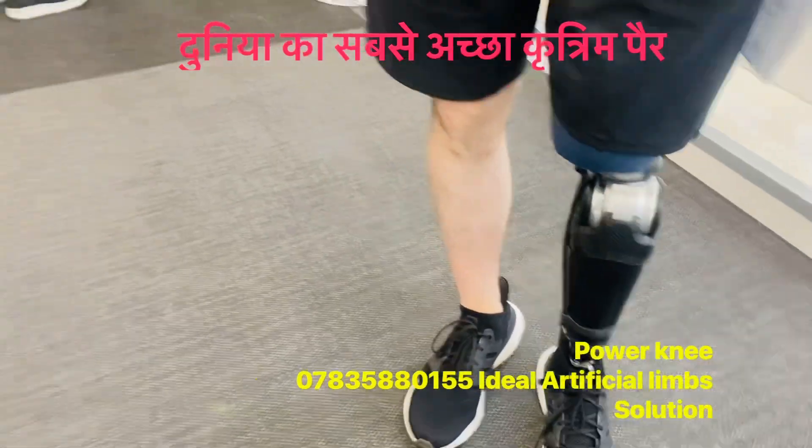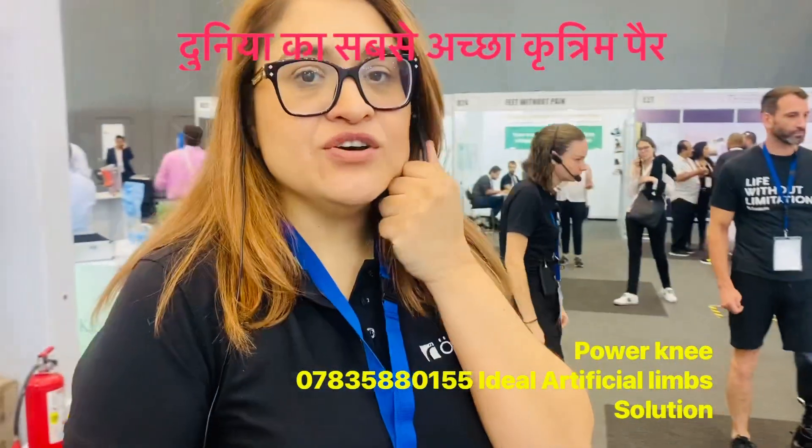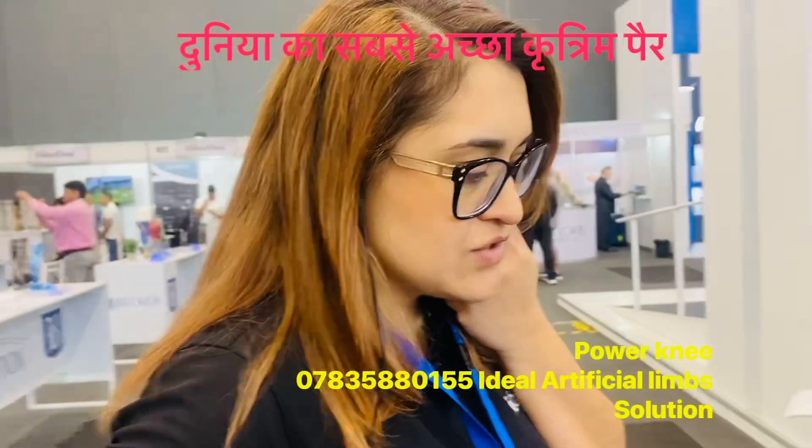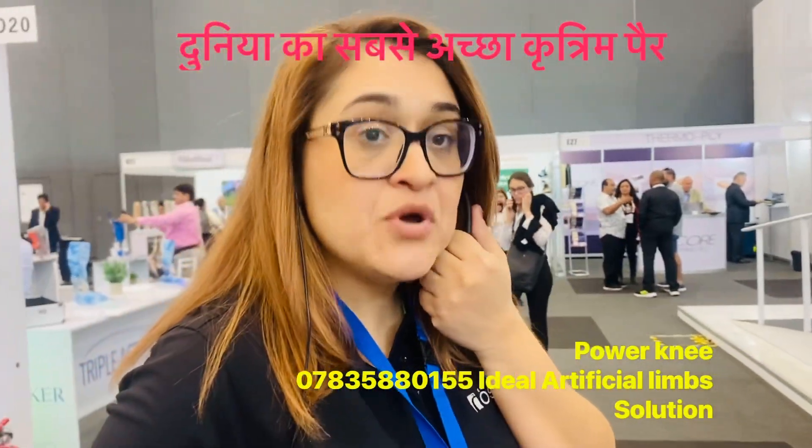So this is a powered knee from a motor? This is a powered knee — it's an active microprocessed knee. We say it's completely different because it has a motor.